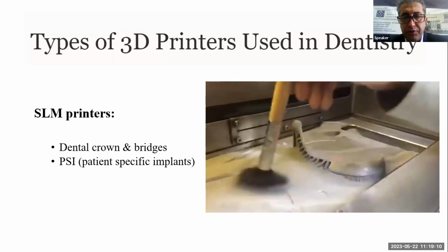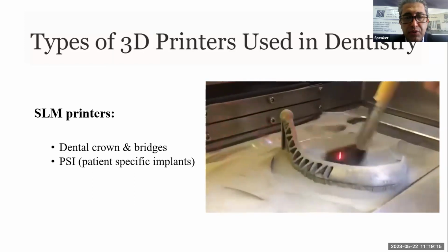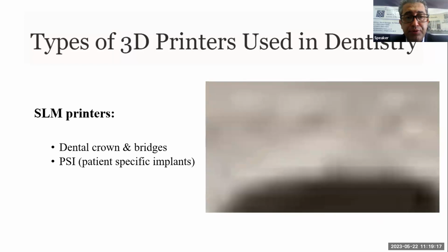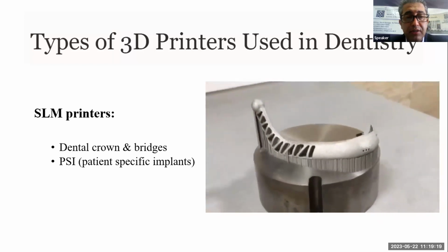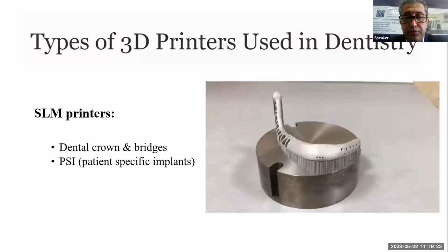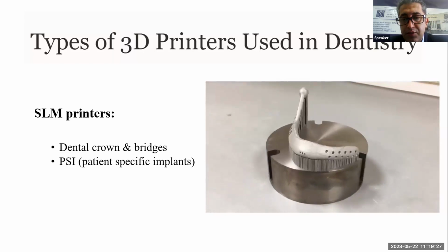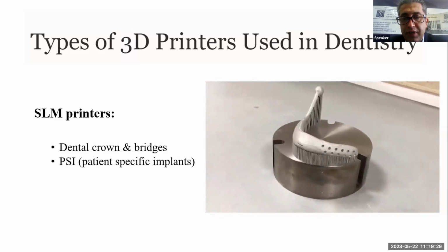Okay, because of the high resolution and good quality of production, with this kind of printer, SLM, we can make dental crowns and bridges, and most especially fabricate PSI, or patient-specific implants. This is one of the patient-specific implants.